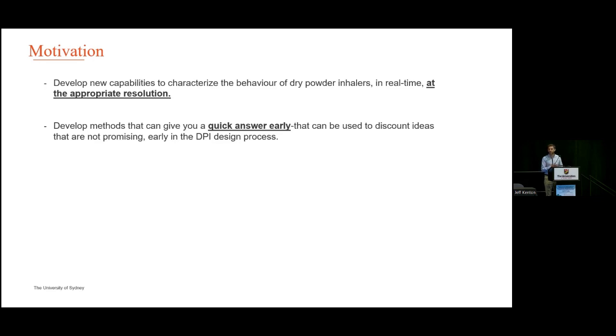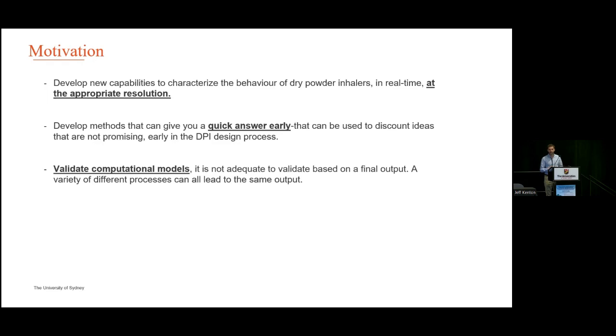Is it behaving similarly to this other device, for instance, if you're developing a generic? So it's something that can be used to essentially discount ideas very quickly. A lot of what we do is integrating these high-speed, high-resolution diagnostic techniques into DPI so that we can get this kind of very quick feedback on what's happening.